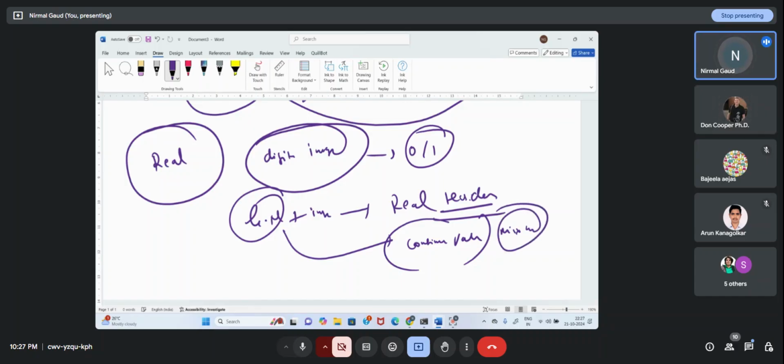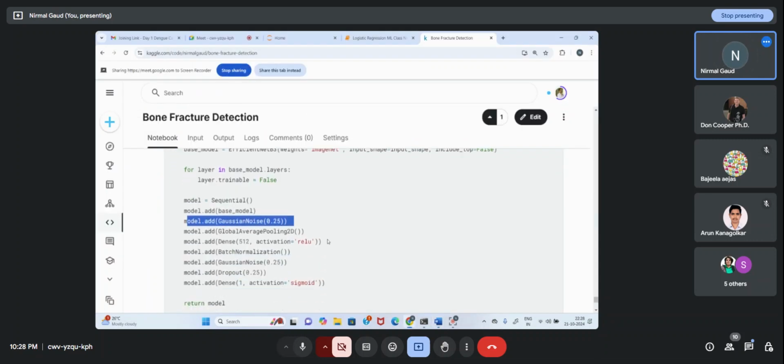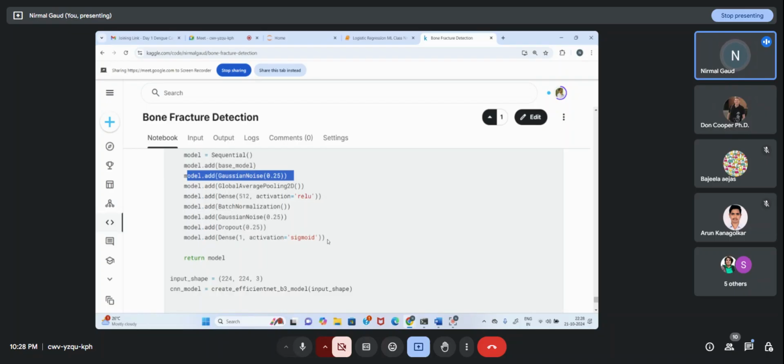Yes, you are absolutely right, sir. There is an increase in the noise, but sir, I want to give a real feel. In case my model is struggling and it is difficult for it to understand the pattern, let me add something from my side, like a Gaussian distribution, so that by interpolation the pattern can be built up. Some smoothing can be added, sir. I tried whether the behavior of the images can be smoothed by adding this Gaussian distribution. Some fraction of Gaussian, I think 0.25, I took, adding some fraction of data points into the images. Then I'm trying to capture the features.